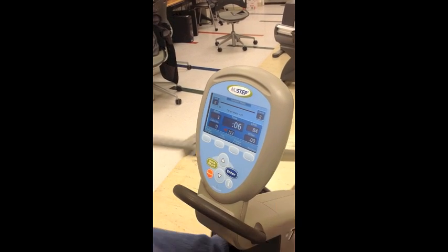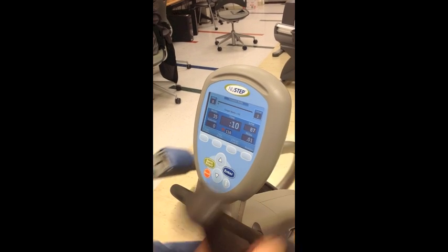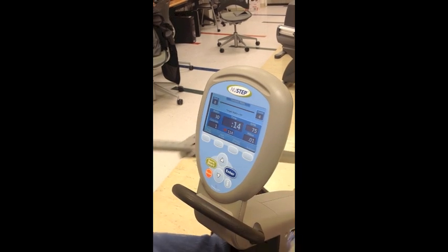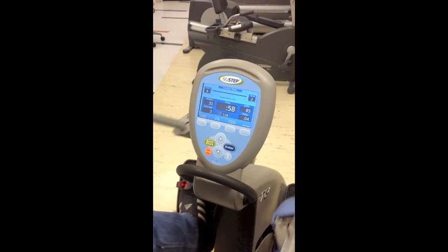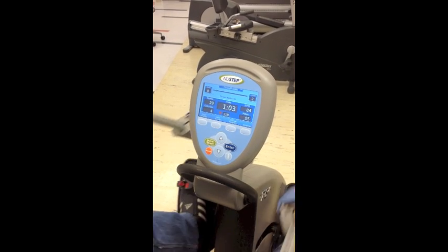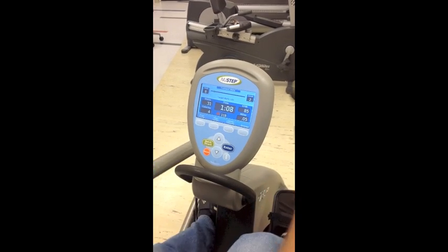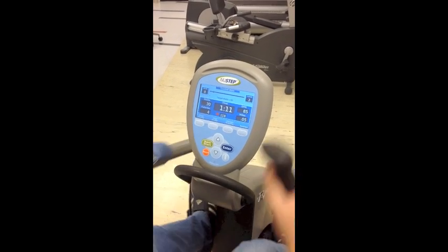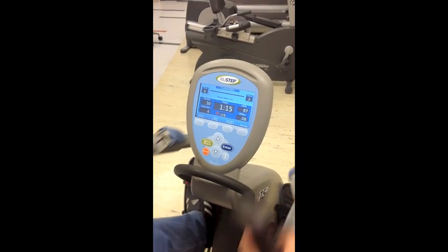Instruct the participant to try to reach 90 steps per minute. However, because we are using Constant Power, the individual can find a step rate that is comfortable for them. The most important part of the exercise test is that they keep a constant step rate. Once the participant has gone through one minute, we are going to start assessing heart rate for minute two and minute three of this stage.